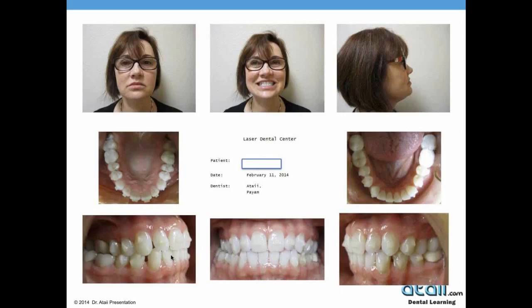We couldn't believe that in 6 months, as promised, not only did we close the anteriors, but her decision in not having the surgery or having the option of correcting the posterior crossbite was fine. We gave her the options, but in her particular case, her chief concern was premolar to premolar. And you can see that arch development looks beautiful.